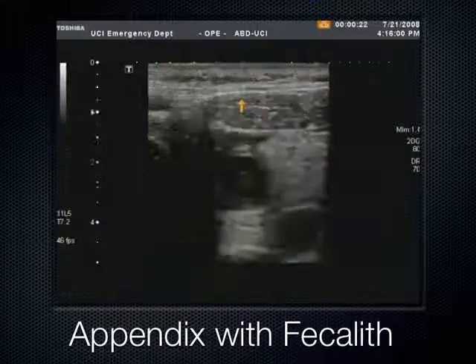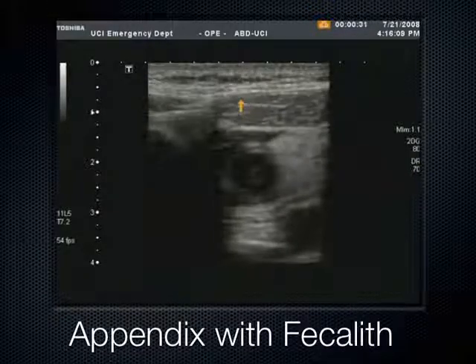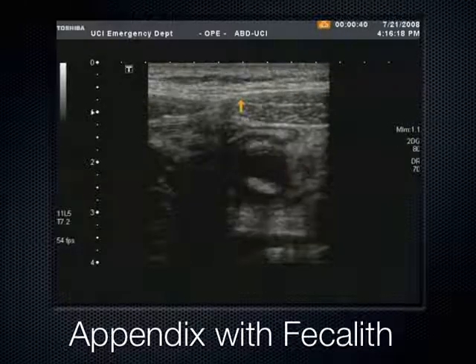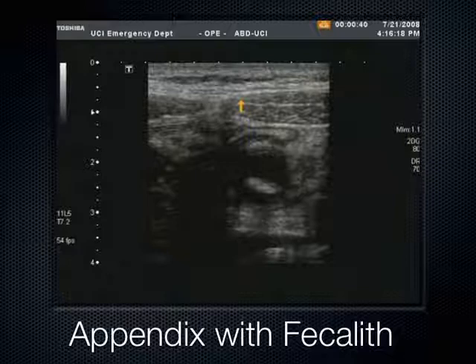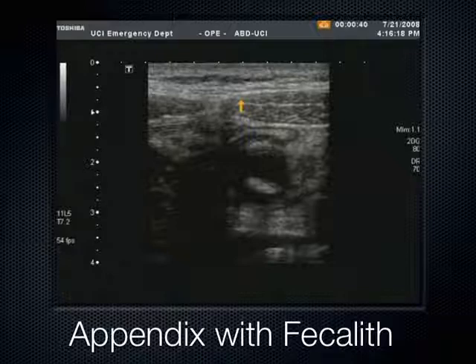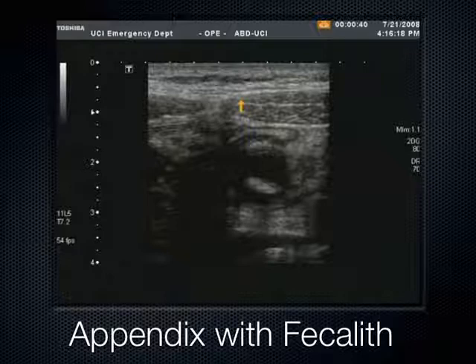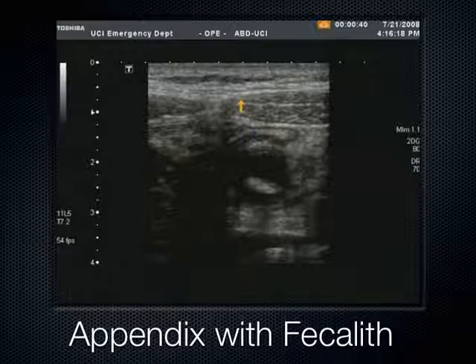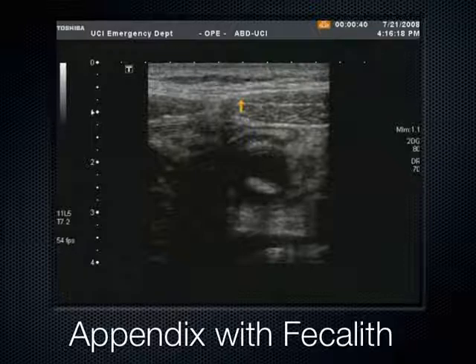Here's one last example of appendicitis — the abdominal wall musculature and psoas smooshing this appendix. This one has a little fecalith — literally a poopstone — inside the appendix. The fecalith obstructs the opening of the appendix, which then gets larger and larger and can't drain its contents. Eventually the pressure inside exceeds the ability of blood vessels to supply it, causing ischemia, the walls get thin, and the appendix perforates into the peritoneal cavity. Once perforation occurs, surgery is often not of benefit — you give the patient antibiotics for a couple of weeks and admit them.